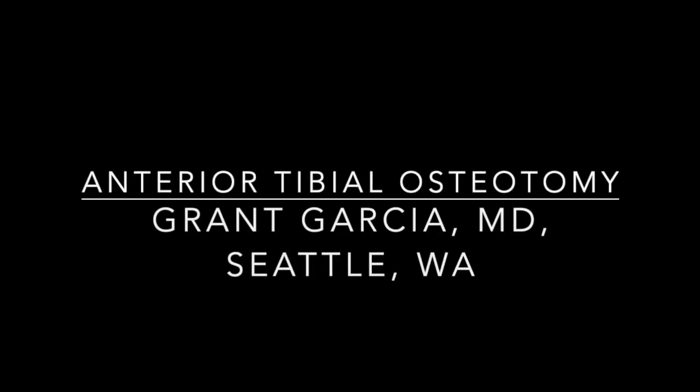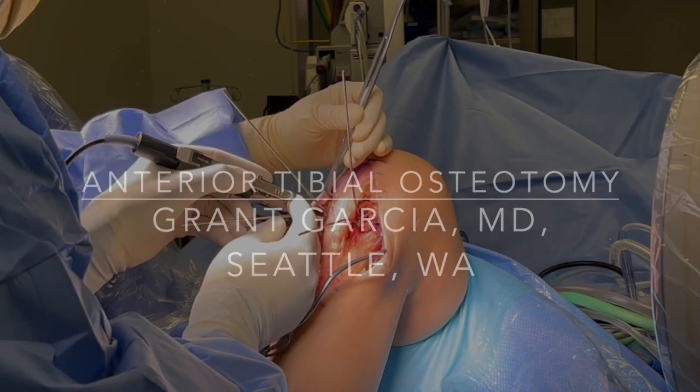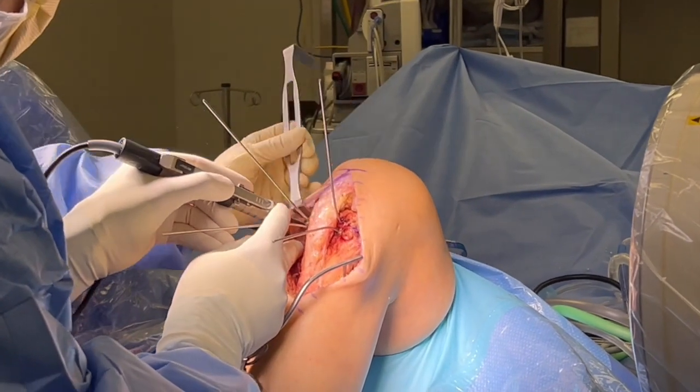Today we're going to show our technique for anterior tibial osteotomy. This is a closing wedge. This patient had failed ACLs, multiple of them, with a high tibial slope over 13 degrees.